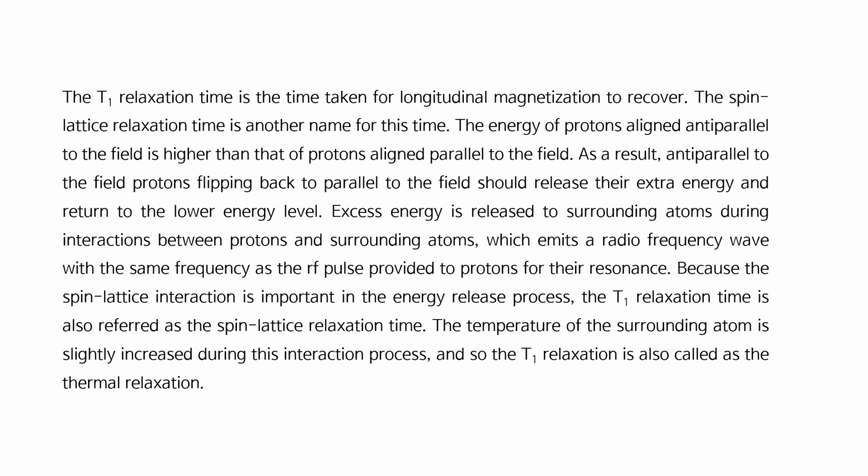The T1 relaxation time is the time taken for longitudinal magnetization to recover. The spin-lattice relaxation time is another name for this time. The energy of protons aligned antiparallel to the field is higher than that of protons aligned parallel to the field. As a result, antiparallel protons flipping back to parallel to the field should release their extra energy and return to the lower energy level.